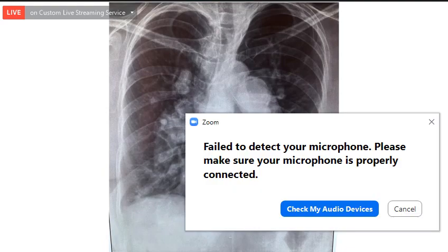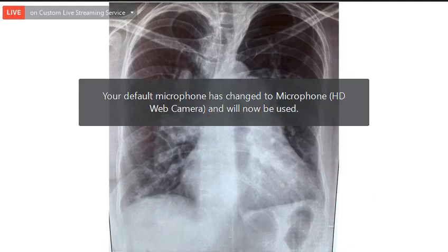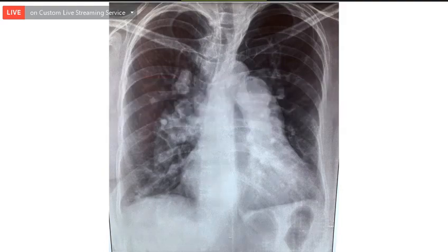Yes, sir. Good evening, sir. X-ray chest, PA view. Sir, showing situs solitus. Sir, you told over-penetrated, we can see the spine. Now, sir, regarding cardiomegaly, it is either borderline or normal. Probably it is normal, sir. Maybe I would consider mild cardiomegaly. Yes, mild. Right.